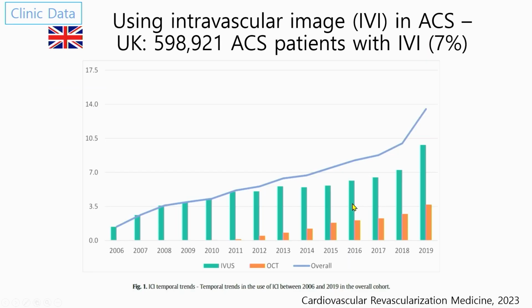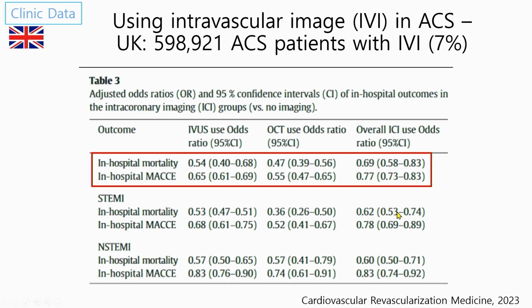How about the UK? In the UK, they increased the use of image guidance from 2006 to 2016, with IVUS or OCT. But even in 2019, IVUS-guided use is less than 10%, and OCT-guided is less than 4%. So only about 14% of patients use imaging in daily practice.